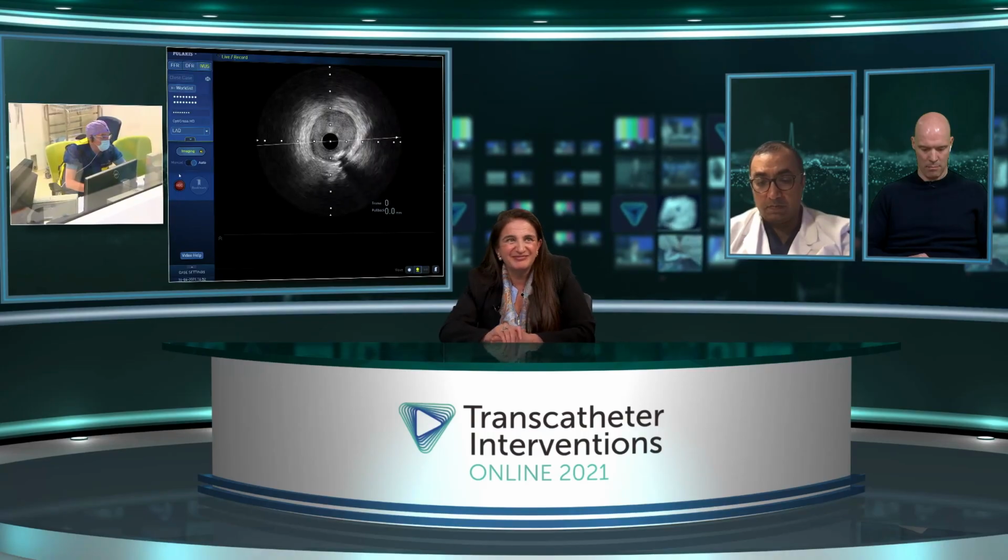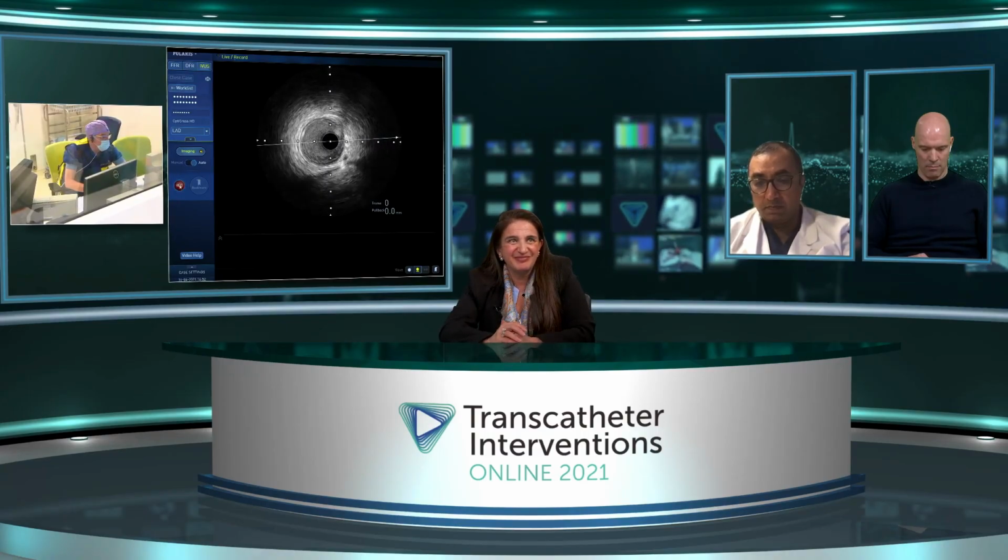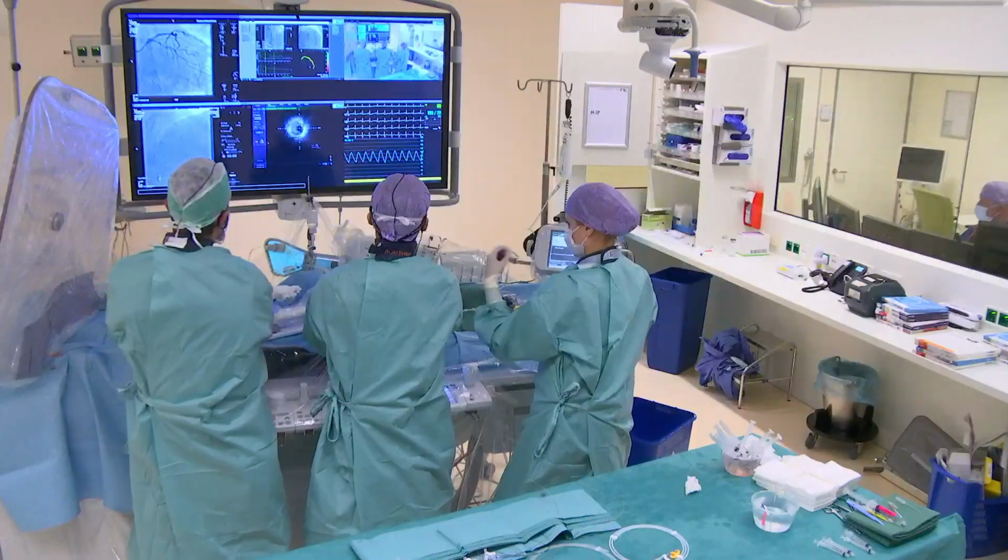Okay. So we'll quickly do the IVUS run and then give you an angiogram. Leave it there, and then I think, Joost, I'll start pulling back. You make it nicely on time. Pull back. Okay, I started already.